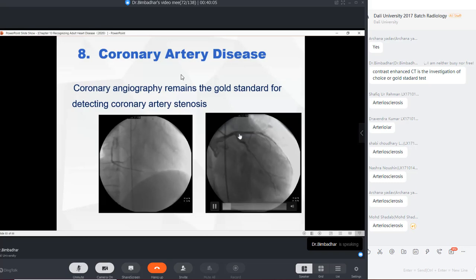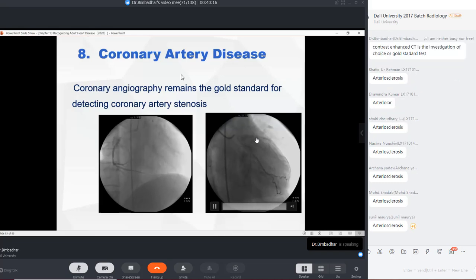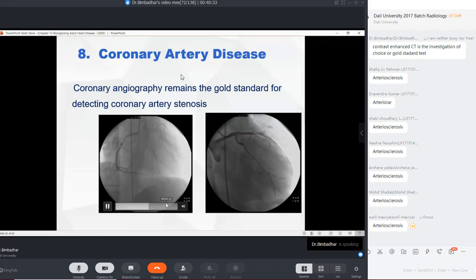You see here, slowly and slowly, at some point this became so narrow. Look at this point where I'm putting my finger. The lumen became much more narrow and became very thin. So that is where the obstruction is. Can everybody see it?